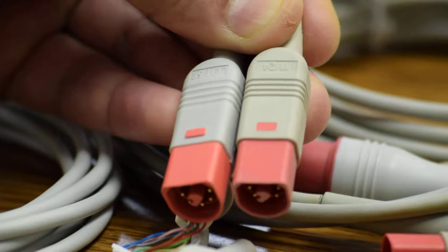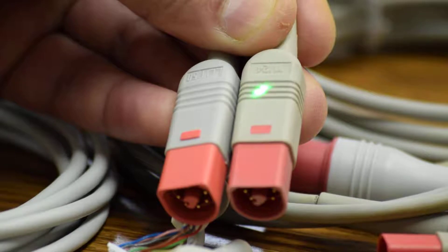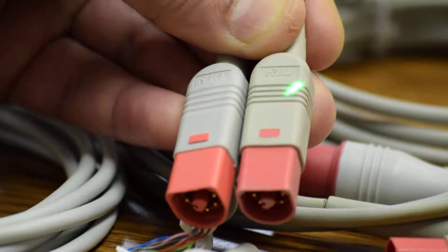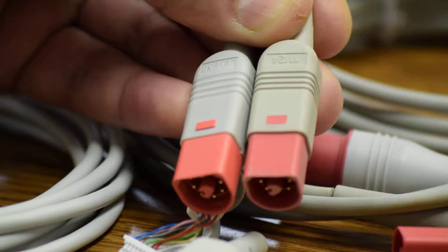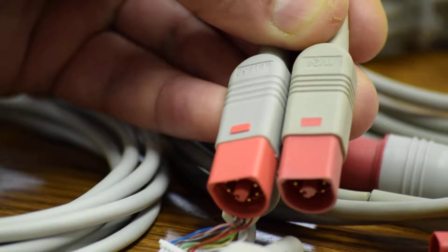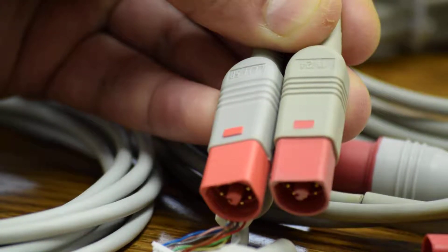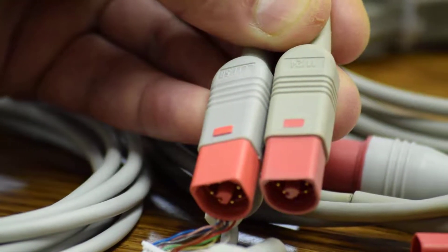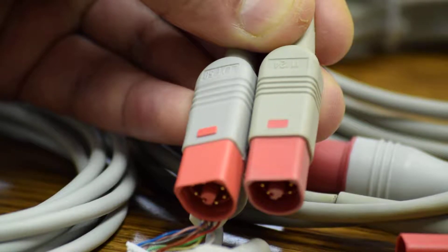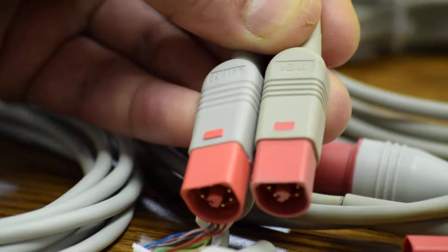The aftermarket part is non-OEM or non-Philips. It has a different imprint: 11/24. The look is very deceiving, as the aftermarket part looks like the original Philips connector. However, there is a very distinctive difference in the process used for manufacturing.